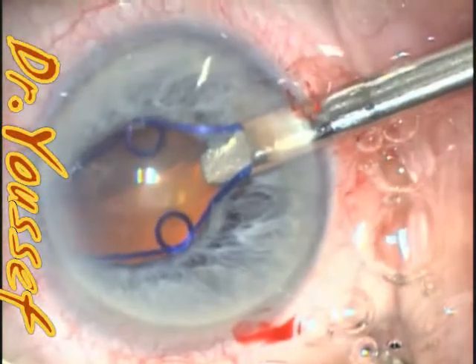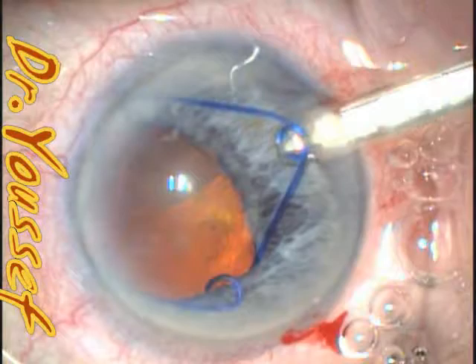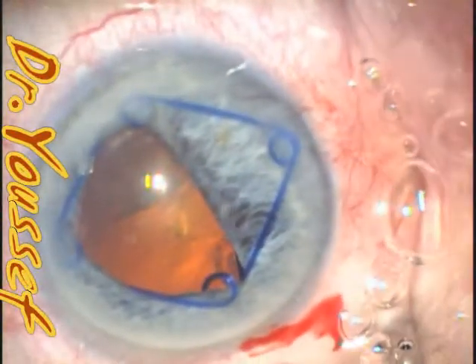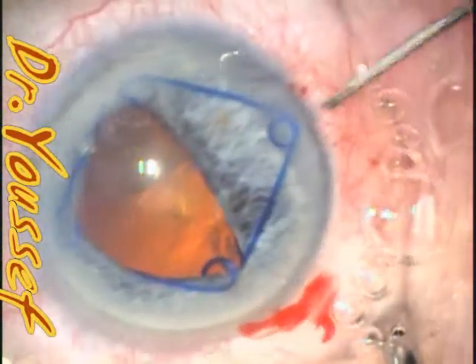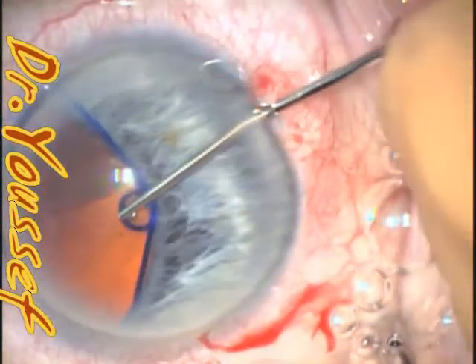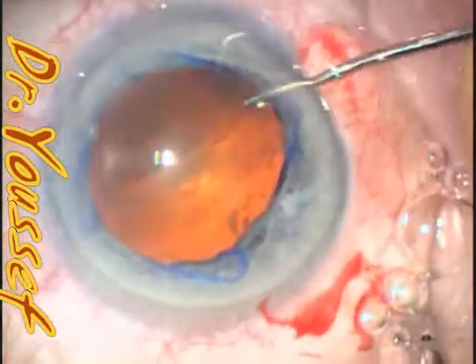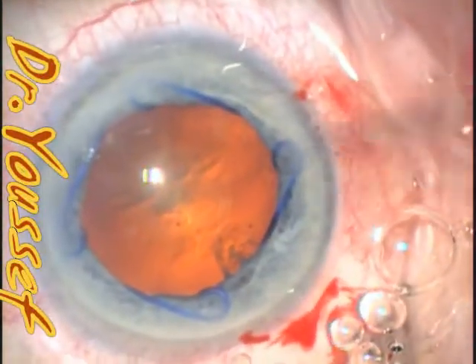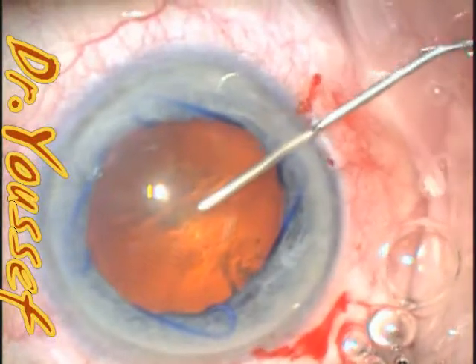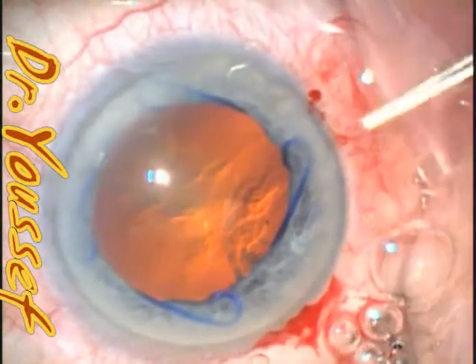So I retract it a little bit because it is missed, and then I rotate to the other side and engage the lower part, and then rotate it 90 degrees so that it doesn't hook it. So the trailing one is engaged, and then I'll refill the chamber using viscoat because we lose some of that, and we don't overfill at the beginning. So now we filled it.